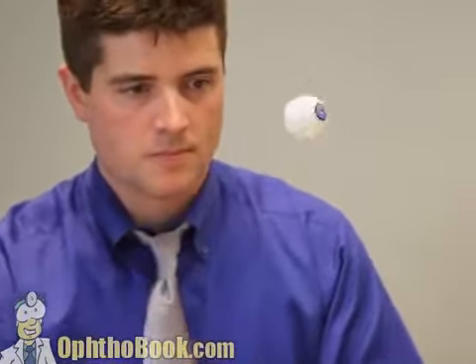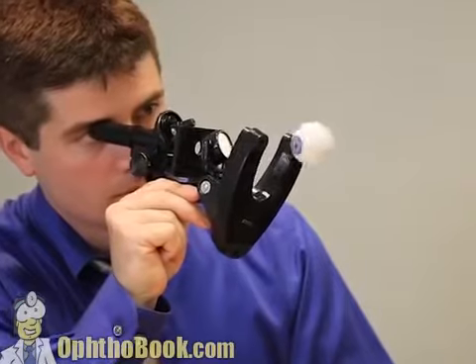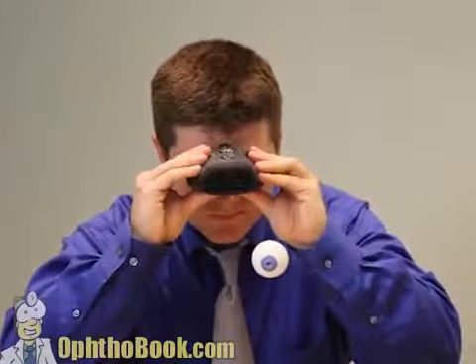But our patients don't like to lay flat. They like to sit up. And so we need to take a microscope and move it so it's in a horizontal axis so that we can look at the eye. And so that's what we're doing. Let's improve our design by creating a binocular microscope, 2 of them, but let's meld these together into a single unit so that they're in focus and synchrony with each other, and this is basically the perfect microscope.